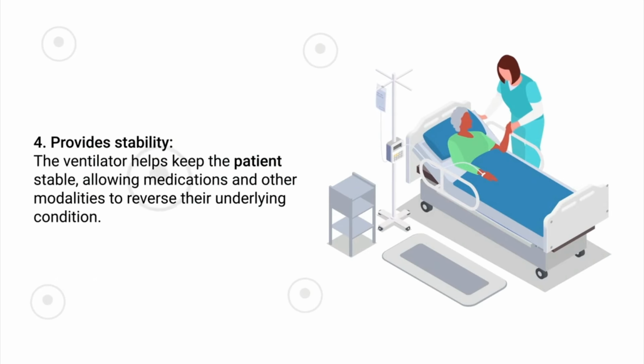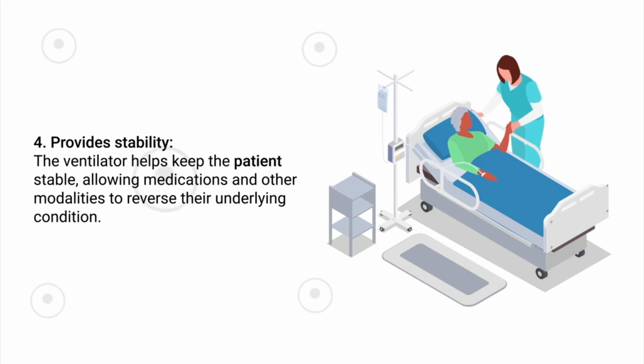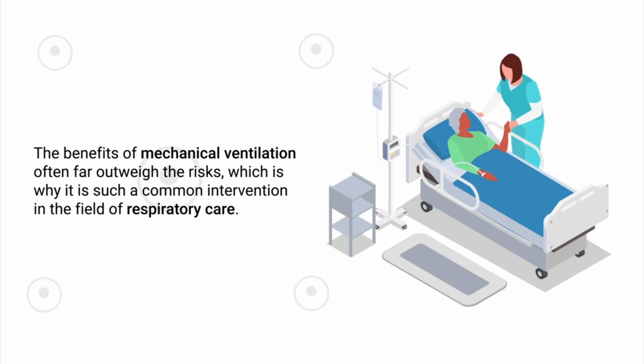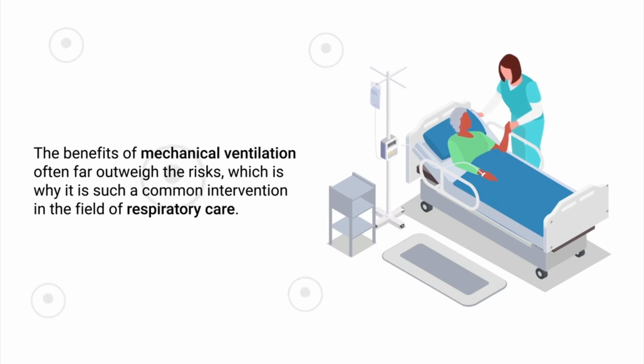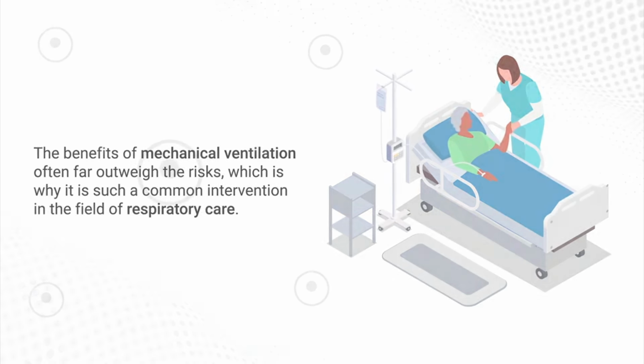And it provides stability. The ventilator helps keep the patient stable, allowing medications and other modalities to reverse their underlying condition. The benefits of mechanical ventilation often far outweigh the risk, which is why it is such a common intervention in the field of respiratory care.